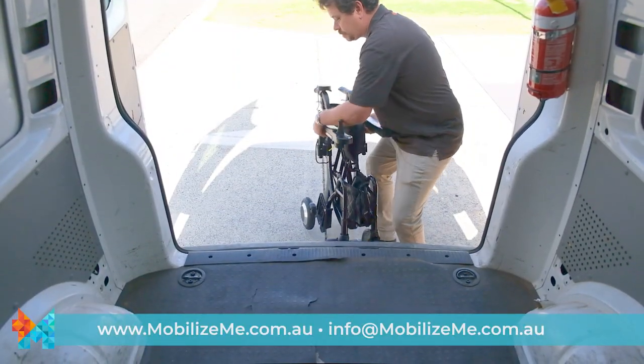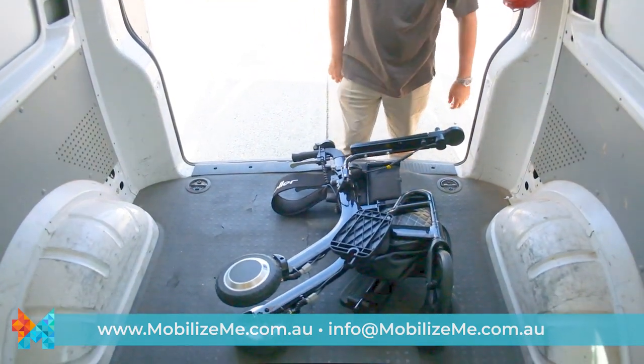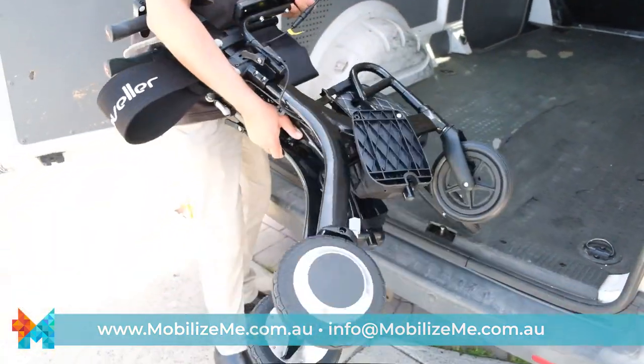You can now load your Evo into the boot of your car or place it in the back seat. Weighing under 19kg including batteries, the Evo is lighter than most electric mobility aids.